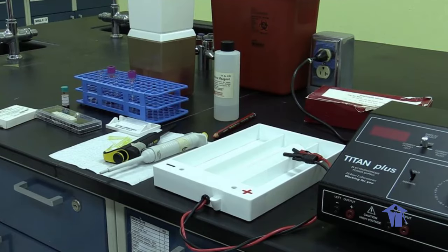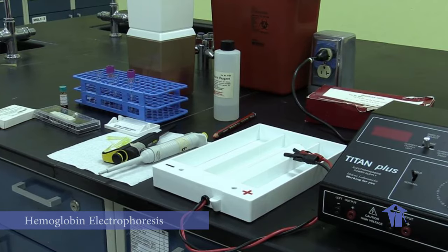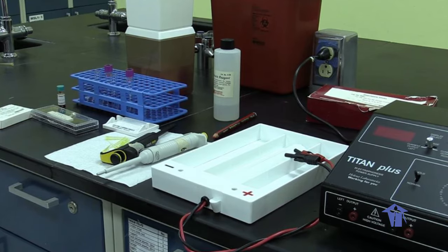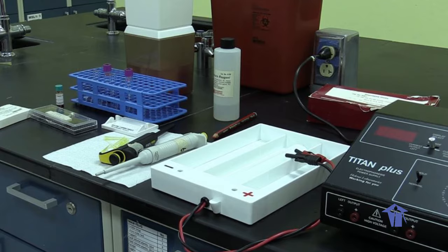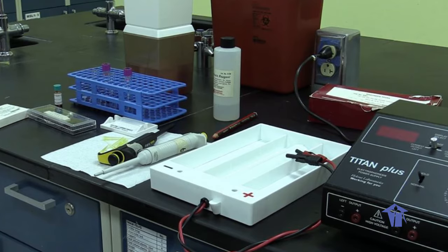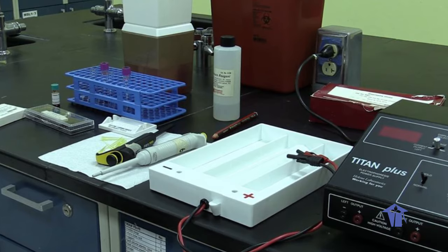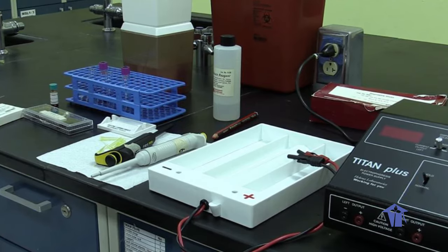This is Laboratory 9 that deals with hemoglobin electrophoresis, and the objective is really to allow the students to become familiar with the technique of hemoglobin electrophoresis, which is a laboratory test that usually measures hemoglobin molecules and their variants in the blood, because there are several types of hemoglobin that are present normally in the adult, and there are variants to these, and we use electrophoresis to determine what are the variants present that may be causing disease, for example, like sickle cell anemia and so on.